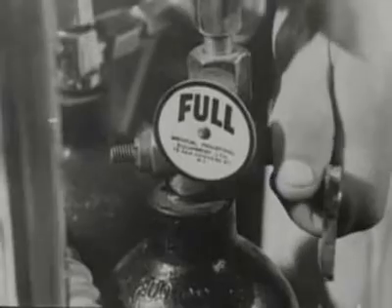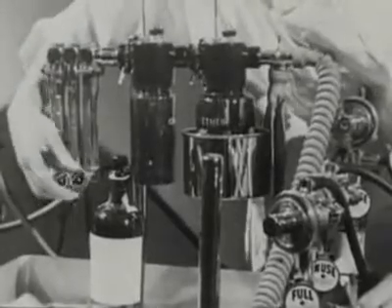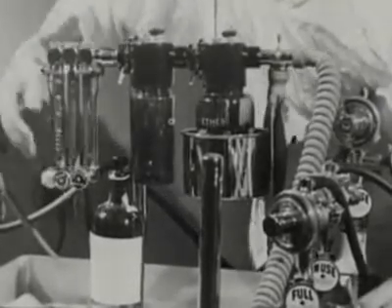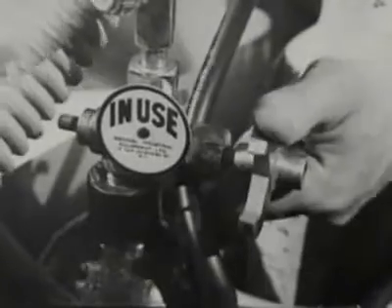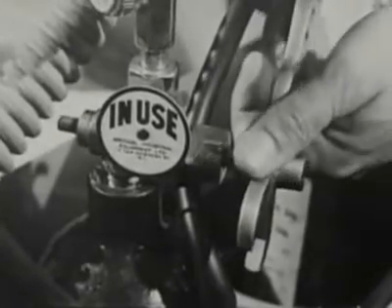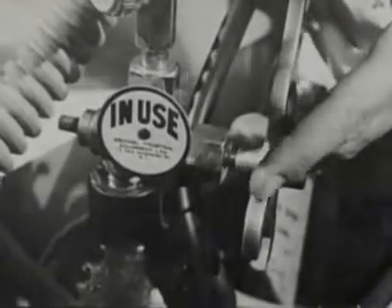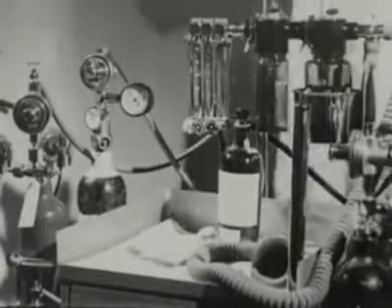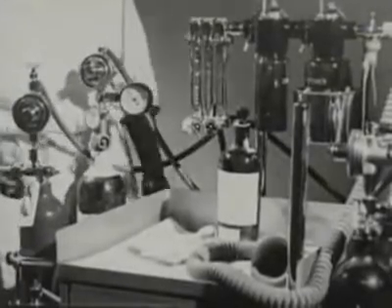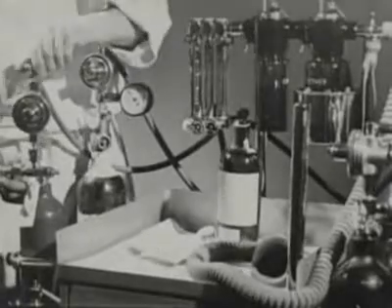Open the spare cylinder and turn the flow meter control until the bobbin rises. Turn off the spare and open the in-use cylinder. Leave this open, but turn off the flow meter. Finally, check the carbon dioxide cylinder in exactly the same way.